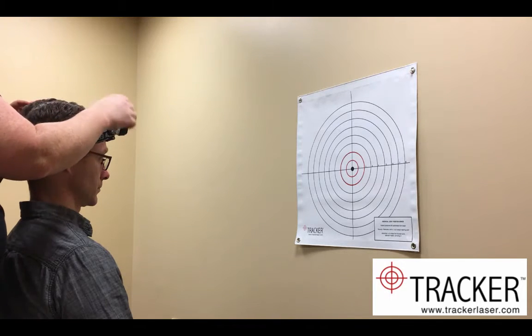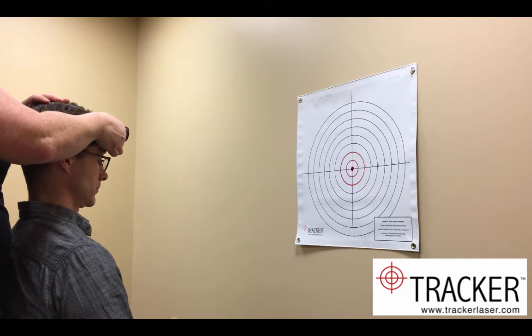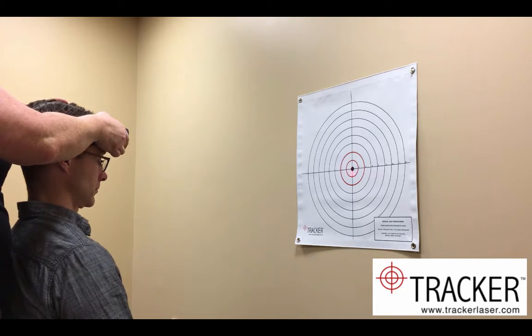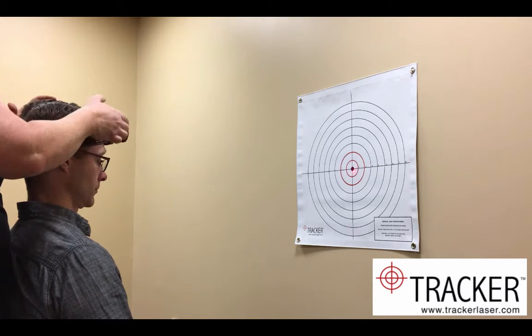Have your patient close their eyes while you turn the light on and adjust the laser to the center of your bullseye. Close is good enough. It doesn't have to be perfect, but somewhere on the black dot.